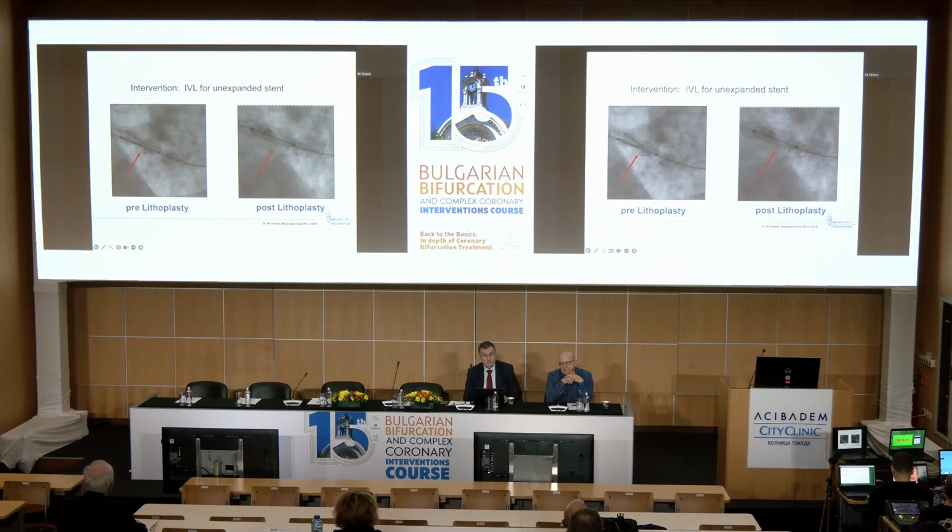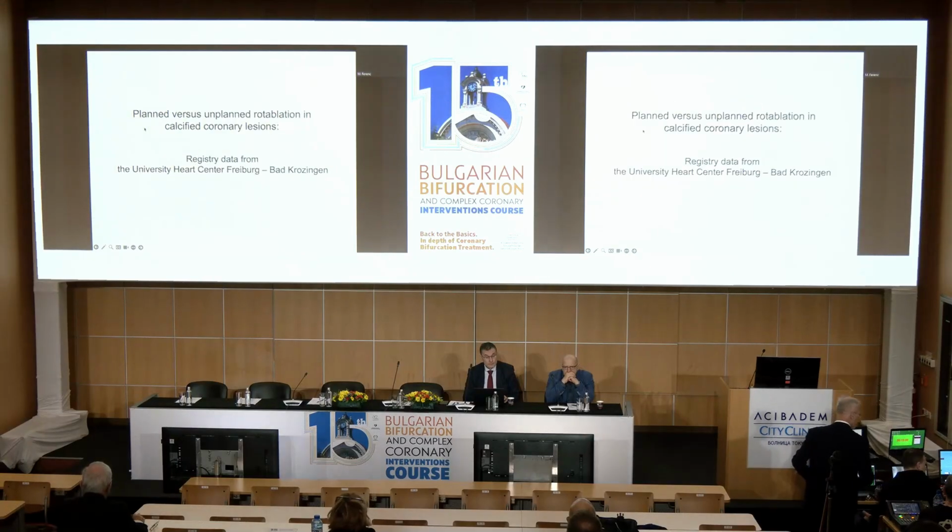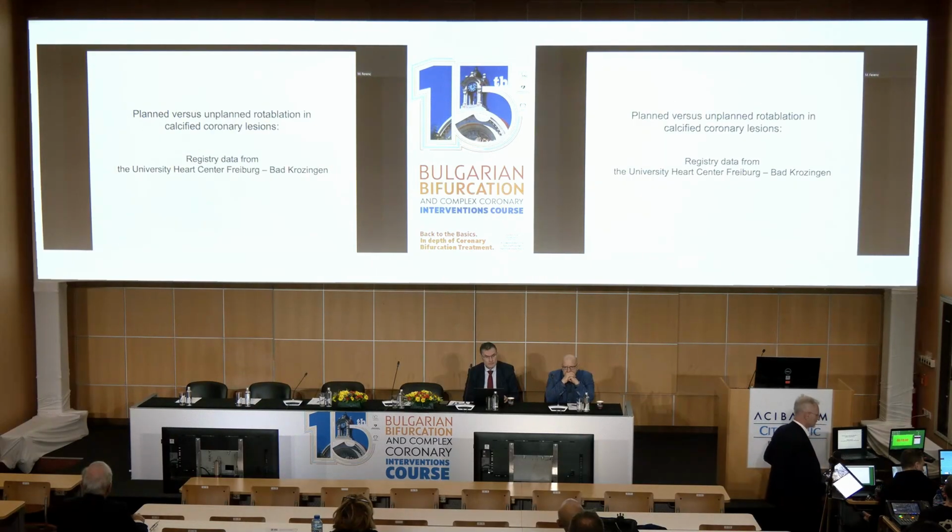You see, you can not only postdilate or predilate with Shockwave unexpanded stents, but this was the first case. I believe this strategy, this method is really working nicely, so I could manage this in-stent restenosis only with Shockwave.